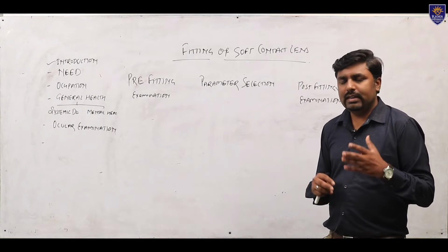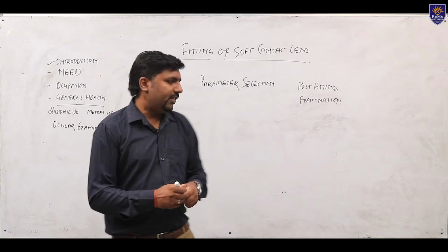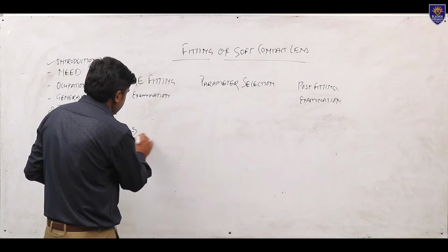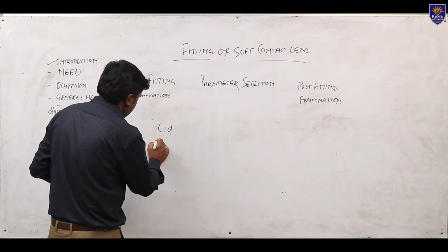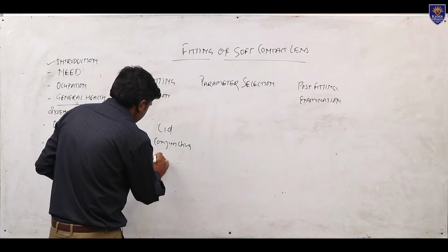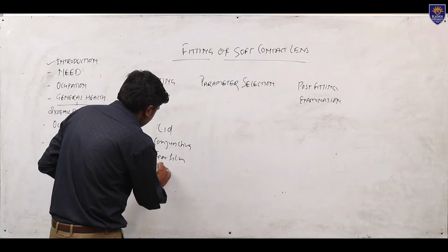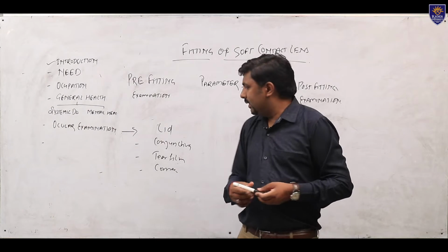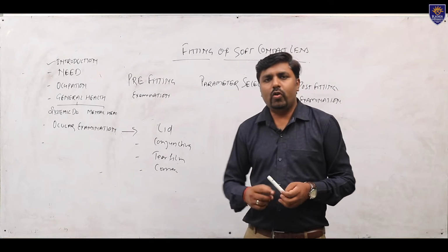We will assess first lid, conjunctiva, tear film and cornea. So, we should know the lid examination, conjunctiva examination, tear film examination and corneal examination.